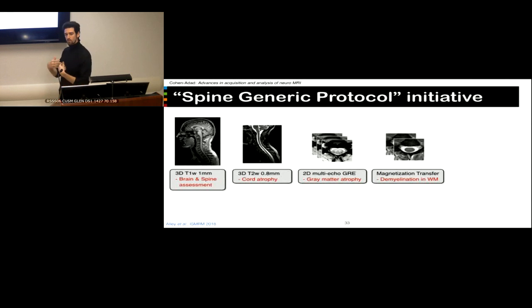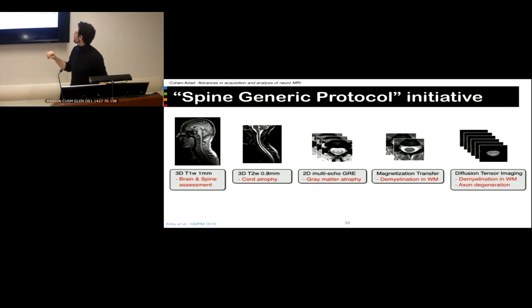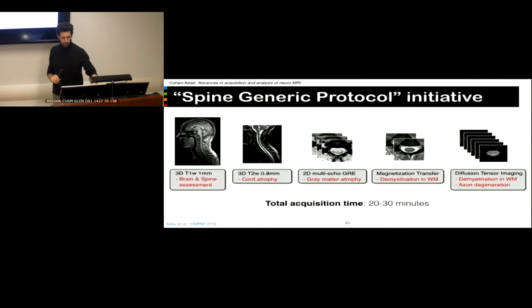It needs to be fun, so we need to add some fancy QMR techniques in there. So there is a magnetization transfer. It's in fact an MTSAT protocol, and a single shell diffusion tensor imaging protocol. So all that run between 20 to 30 minutes depending on the vendor.